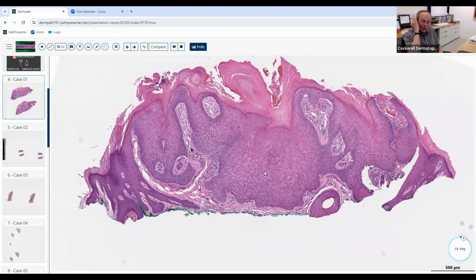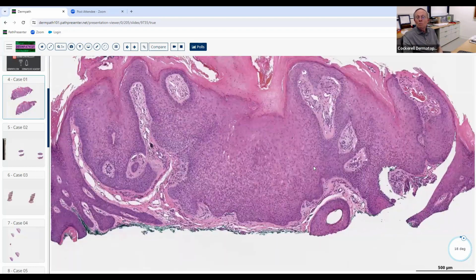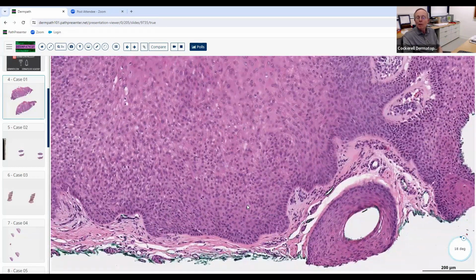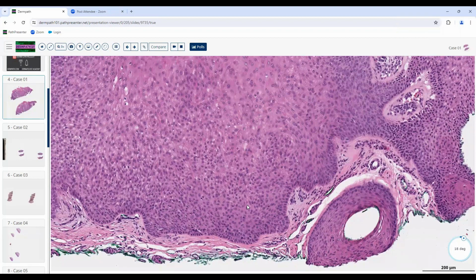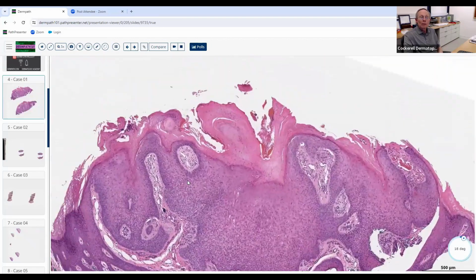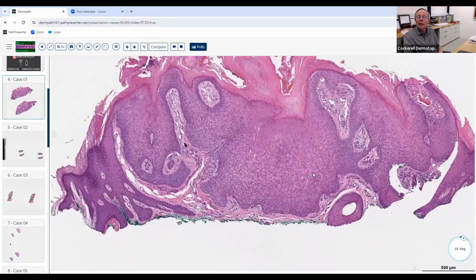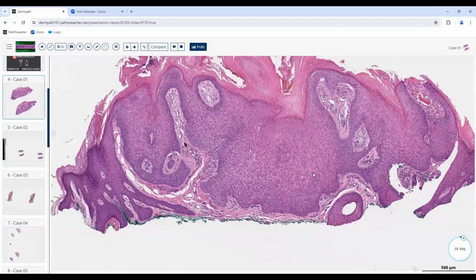Now that usually looks more kind of like psoriasis, a clear cell acanthoma, so it doesn't really have the classic warty architecture. But what do you think clinicians usually mistake this for when they take a biopsy of it? A basal cell. Yeah, basal cell. So they'll probably put that on there. And there might be a few people that look up here and say, well, it's kind of palisaded and maybe there's a little tiny clefting here or something like that. And they'll just apply partial criteria and then they'll miss the answer. Got it. Good news is you would never do that.